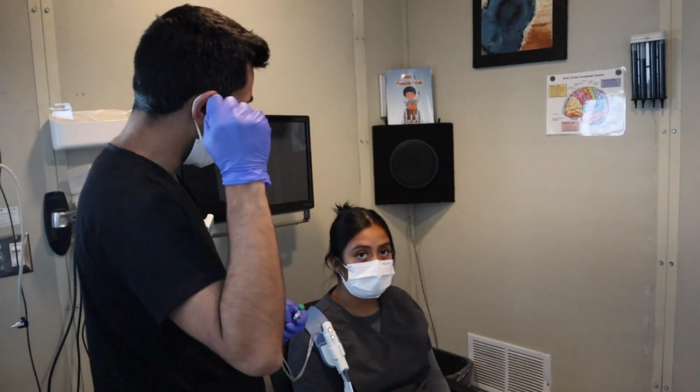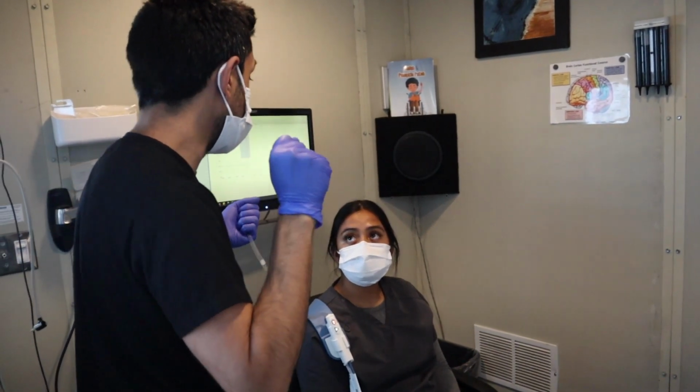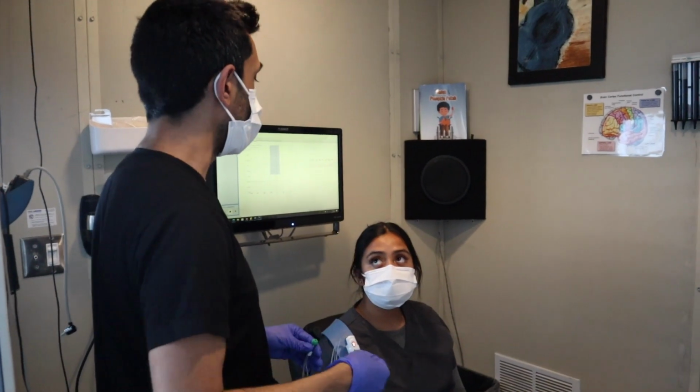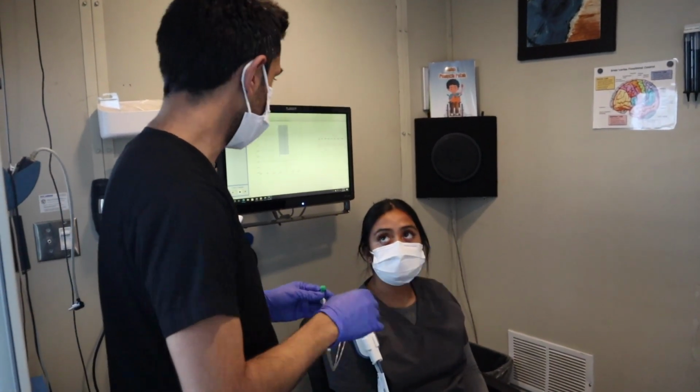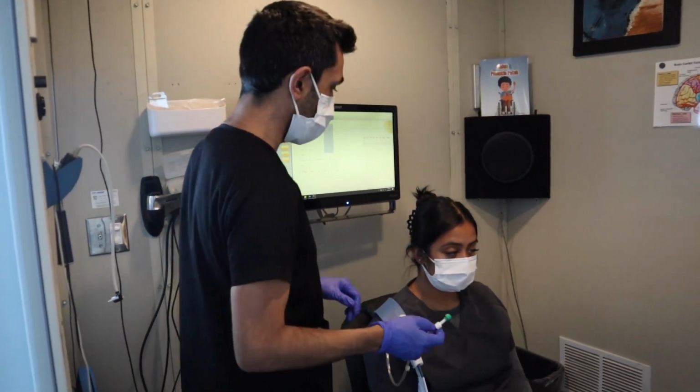But when we're in the test booth, I'm actually trying to elicit that to see if the reflexes are intact at 4 different tones, at 500, 1K, 2K, and 4K hertz. Brief sensation of pressure in your ear. The pressure will come on, and then it will release, and then you'll start to hear intermittent tones that will get louder and louder, but you don't have to do anything. You can just relax from this part. Are you ready?